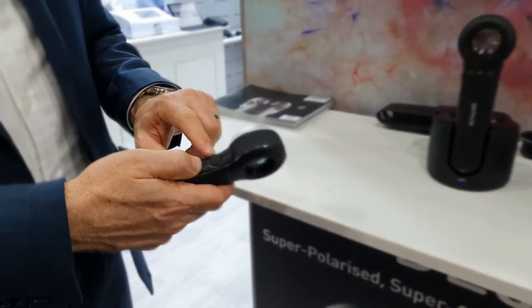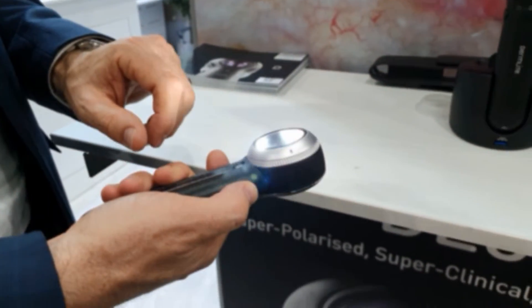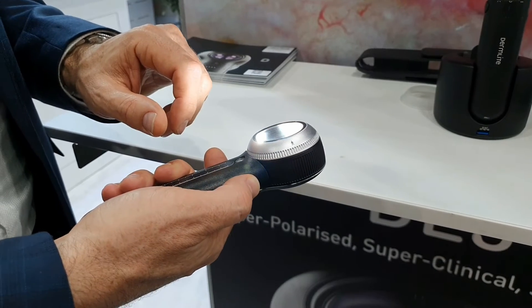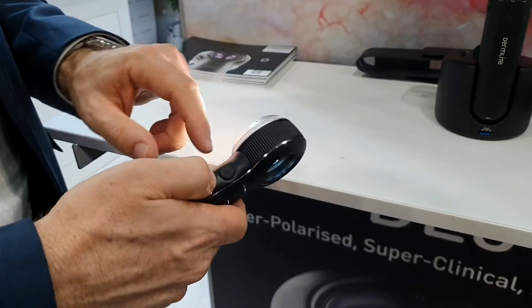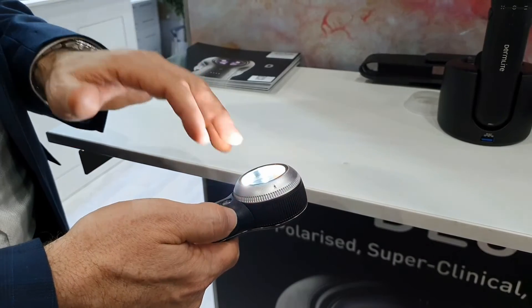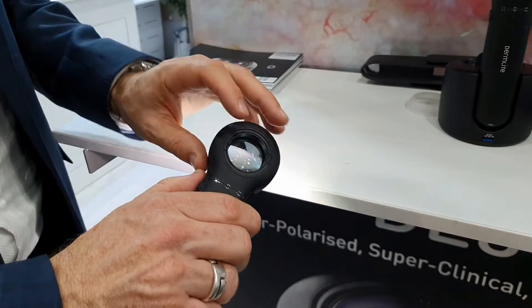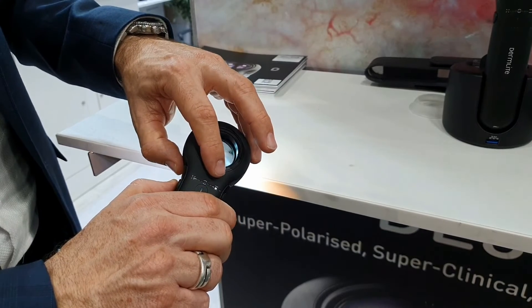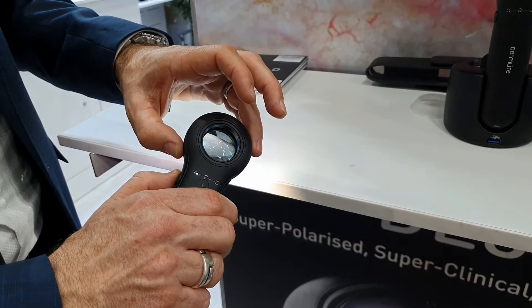With the power button — this button here on the side — just like with the Deal 4 and any other Dermatoscope, we can toggle that button to turn polarized and non-polarized on and back and forth. We can also rotate the wheel on the side and you can see the LEDs blend from one mode to another. On the back it shows cross-polarized, non-polarized, and linear polarized, just by rolling that wheel.